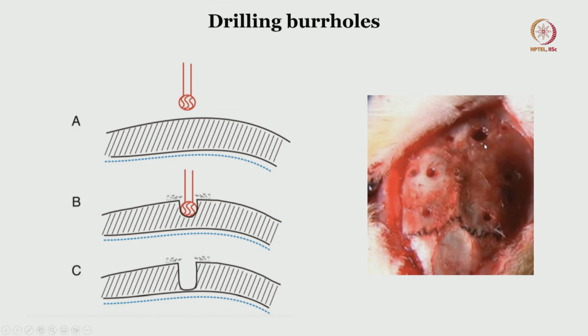Alright. So, before you implant it, you need to put the screws in, and then you will do the final implant, and then start applying the acrylic or metabond adhesives all around to form a single unit for rigid fixation.